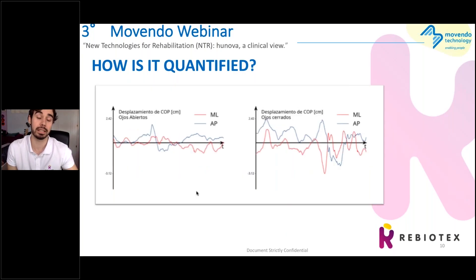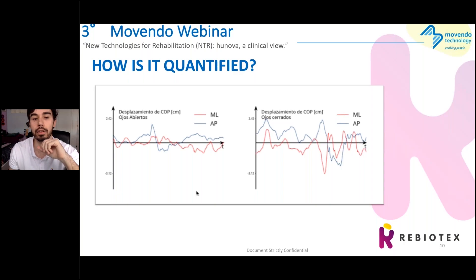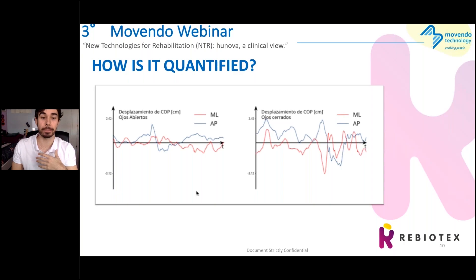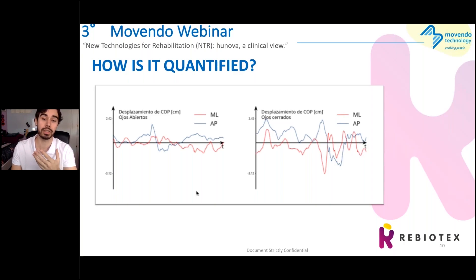This is another graphic from the same exercise — on the left side, the graphic of eyes open; on the right side, the graphic of eyes closed. The red line means the mediolateral displacement. The blue line means the anterior-posterior movement. As we see clearly in eyes closed, we have more movement and more compensation. This is the measurement from the platform.